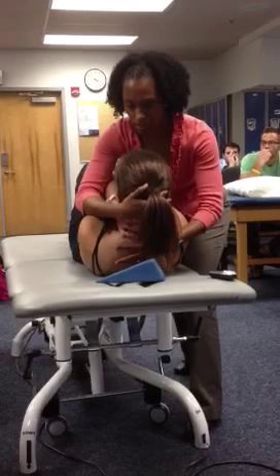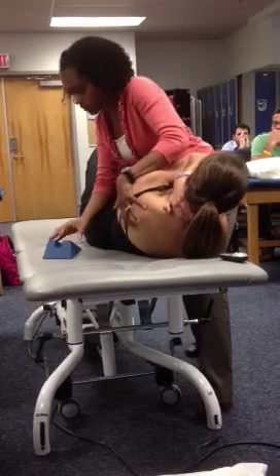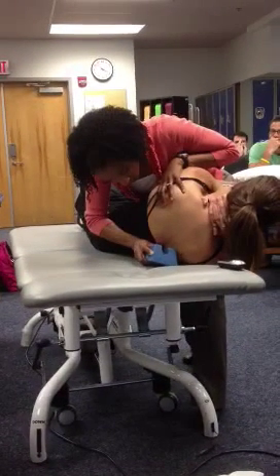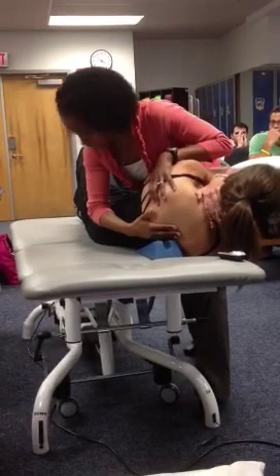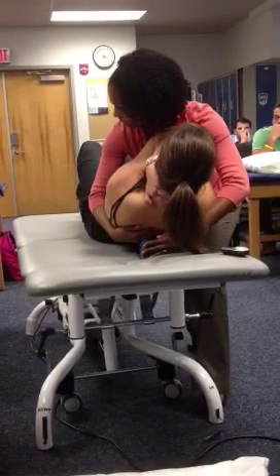One of the modifications I used was still having the patient in this position, grabbing under the shoulder blade, and maybe rotating the patient. But when you start doing that sort of thing, you still kind of compromise the placement of the wedge.